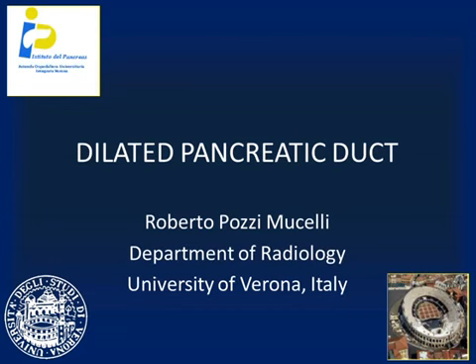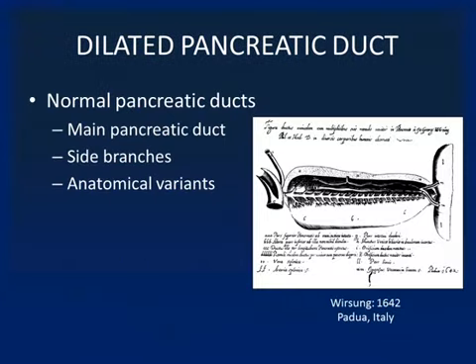So this morning we will discuss this topic concerning dilated pancreatic duct. Before talking about the dilation of the pancreatic duct, a few words about the normal pancreatic ducts, which consist of the main pancreatic duct, the side branches, and eventually the anatomical variants.